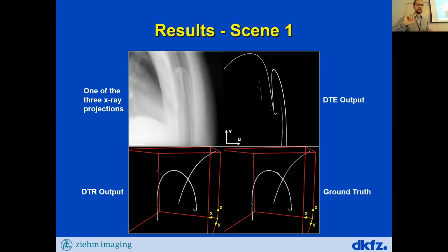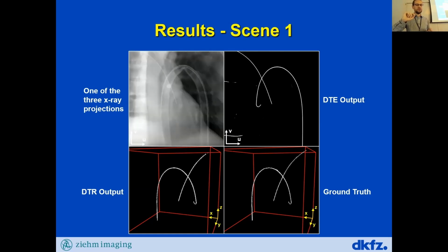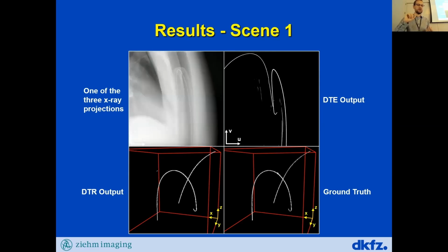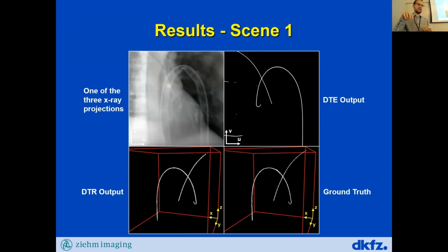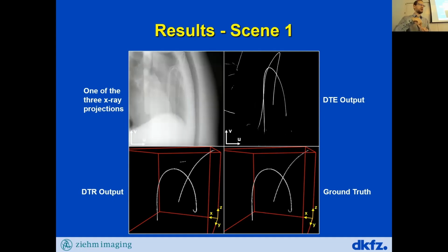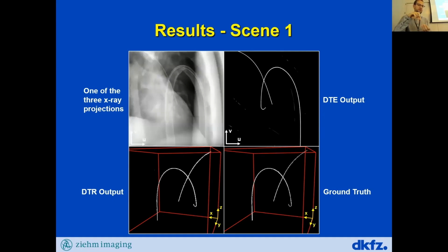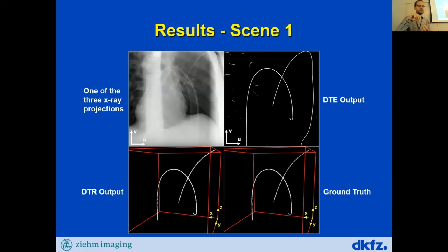This up and down motion of the tools is the simulated patient motion that I was talking about. And if you look closely, you can also see that the curved tip guide wire is pulled out of the patient, because the distance between the curved tip and the straight tip decreases during this sequence.